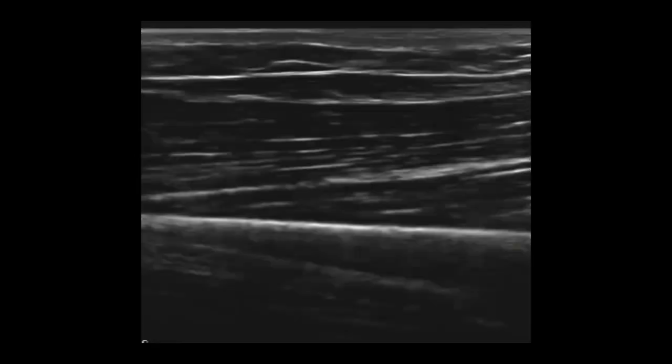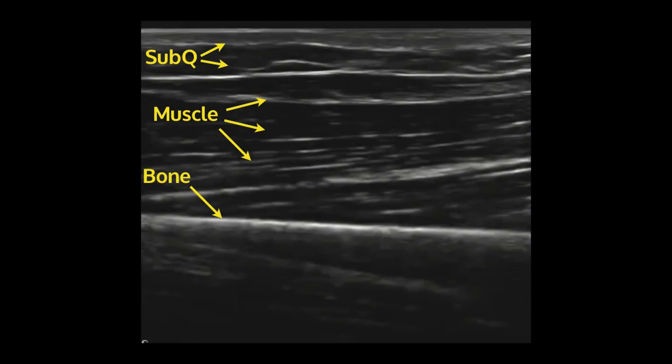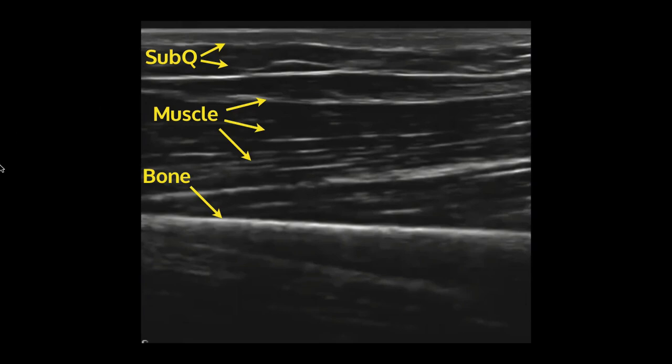What you're really doing with this examination is basically trying to figure out if the patient has cellulitis or edema. You need to know what normal looks like. That bright white hyperechoic line that you see there at the bottom is the cortex of the bone. Above that, you see the striae of the muscle, and then above this fascial plane, you'll see the subcutaneous tissue — and that's what you have to focus on for this exam.